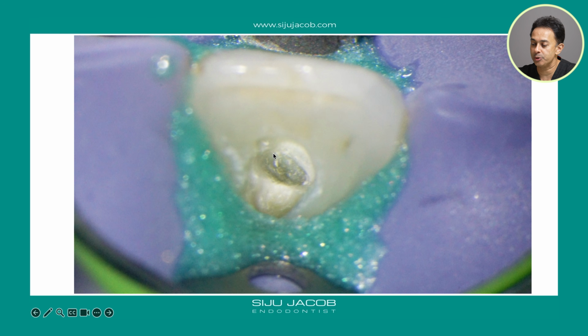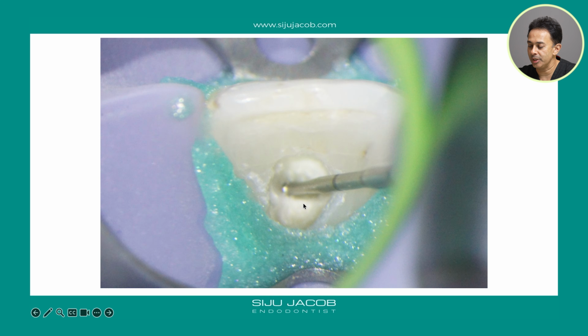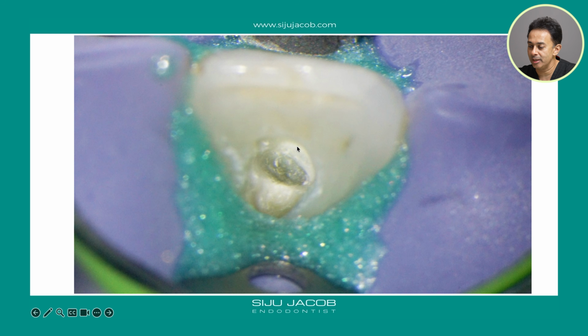This is where the canal used to be, and now it's calcified, and the adjacent monochromatic dentin is whiter in color. So what we should do in this case is not drill in the whiter part here, because that will lead us to perforation, and we avoid drilling on this whiter part also. When we see a case like this and there is a clear differentiation in color between this part of the tooth and the adjacent monochromatic dentin, we know that if we are drilling down the tooth looking for the calcified part of the canal, we need to look in this part and not drill on either side on the whitish part of the tooth, which is what we did.